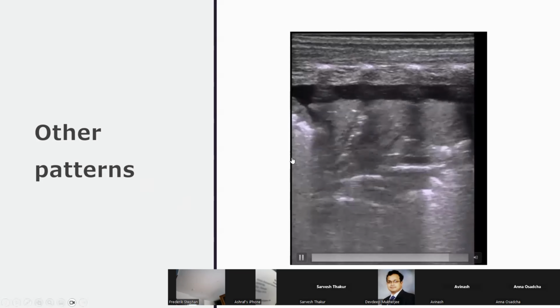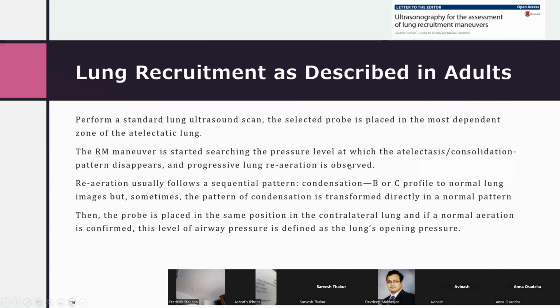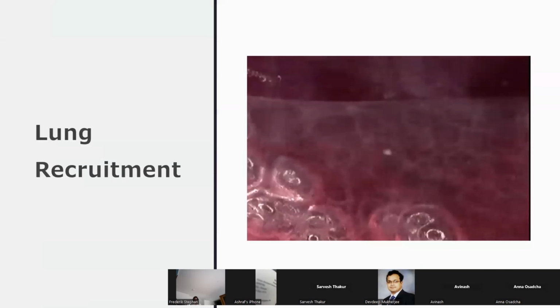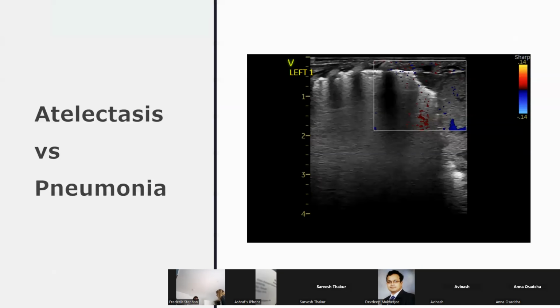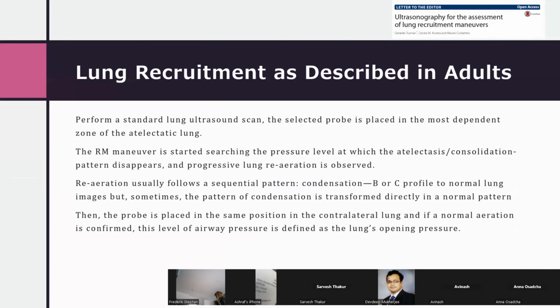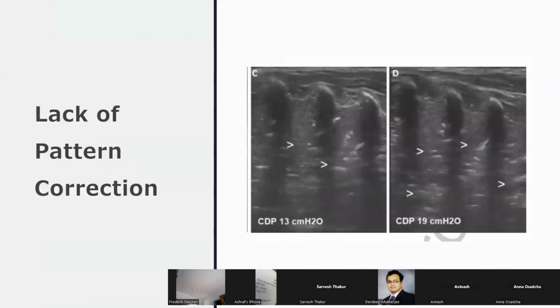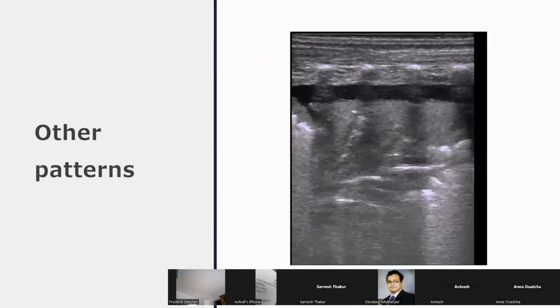Okay. Anything you want to know before that? Now, I mean, if there is any pneumothorax or not, we need to rule out. Very good. So you've done the lung pneumothorax as well. Yeah, it was negative. Okay, don't worry, I'm pushing you.